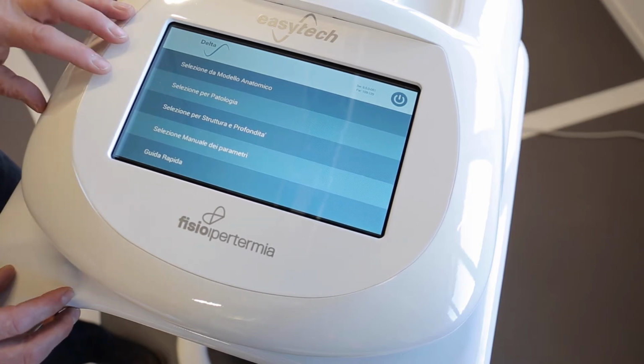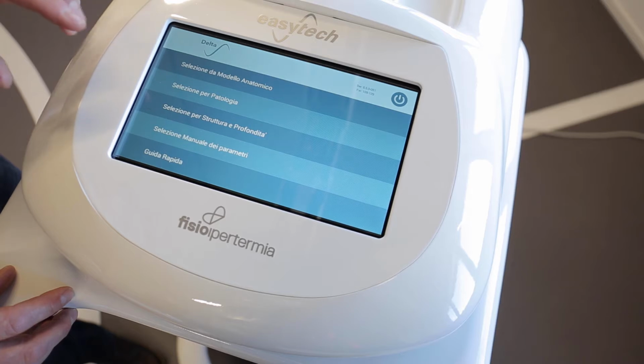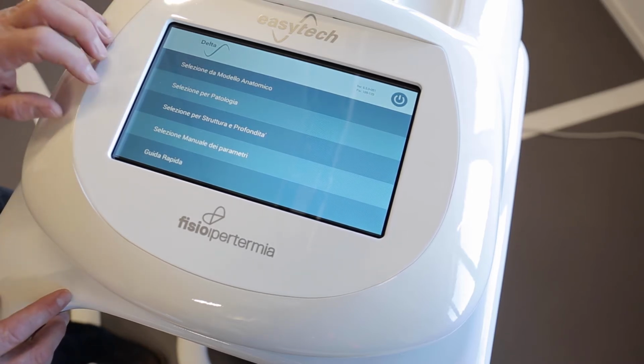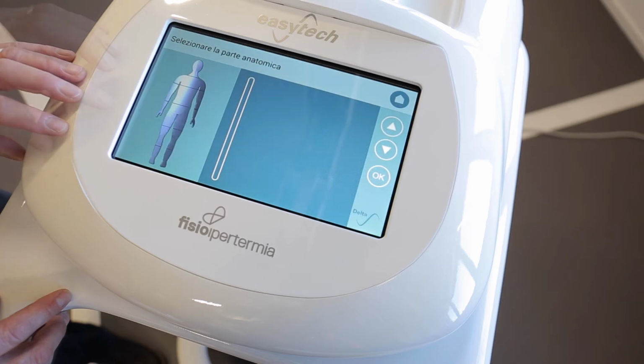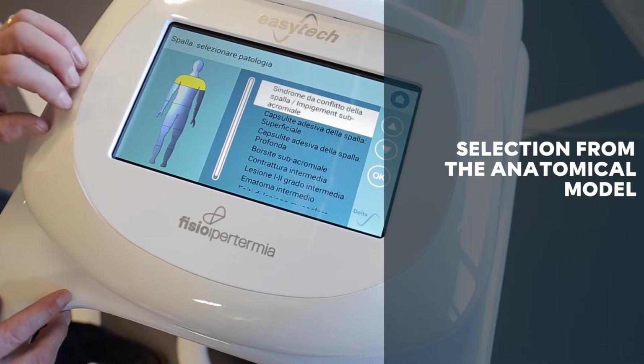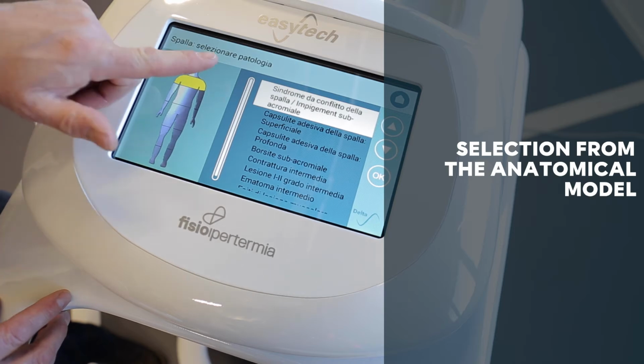The main menu of the software is very intuitive and allows you to choose between various ways of setting the treatment. The easiest way to set up a treatment is to select a body area from the anatomical model. All you have to do is select the area in which the patient's pathology is located.